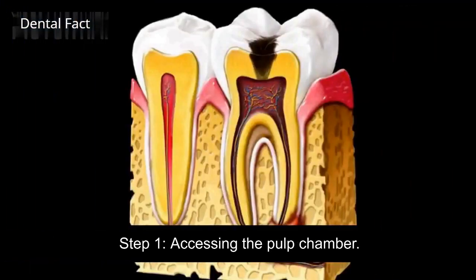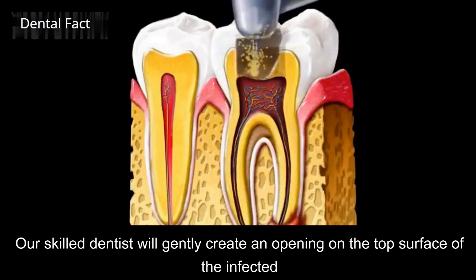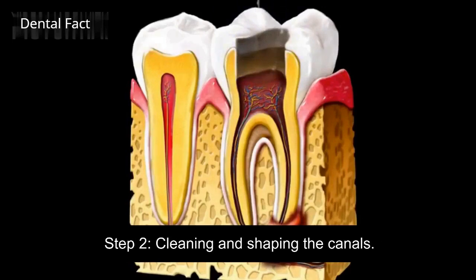Step 1. Accessing the pulp chamber. Our skilled dentist will gently create an opening on the top surface of the infected tooth, providing access to the pulp chamber. Step 2. Cleaning and shaping the canals.